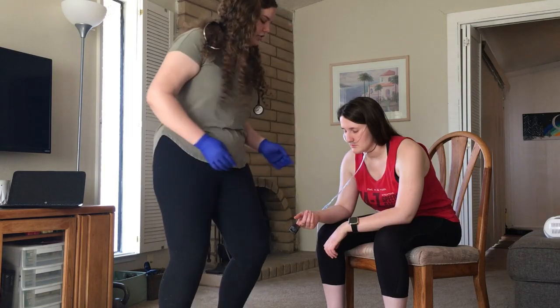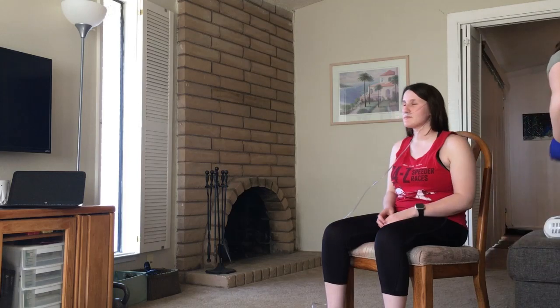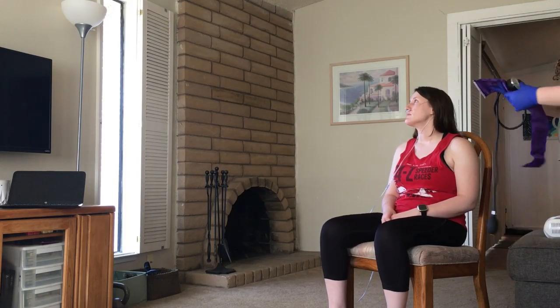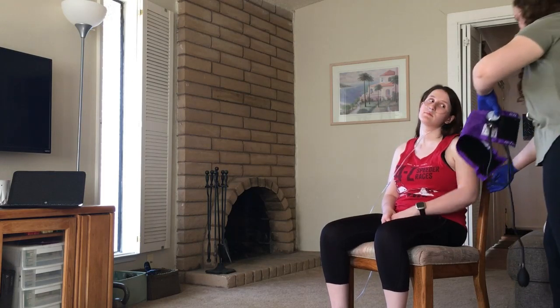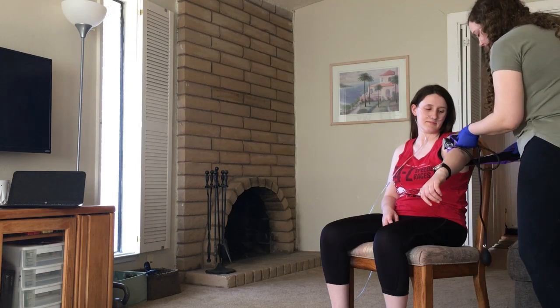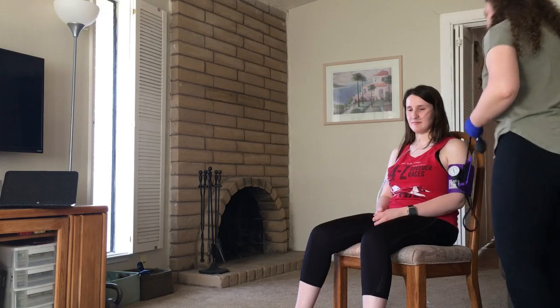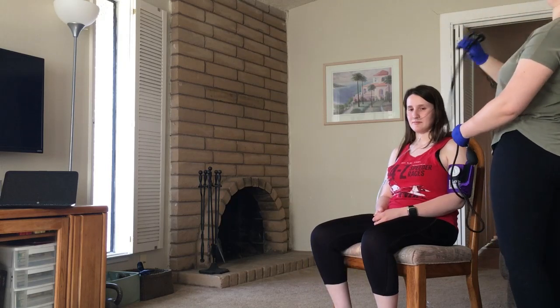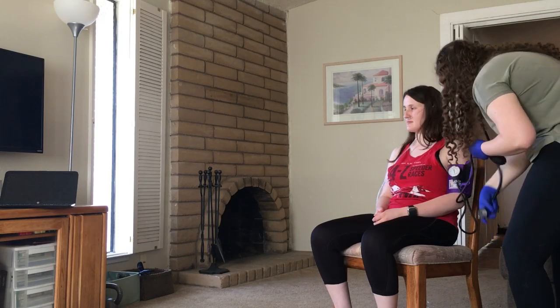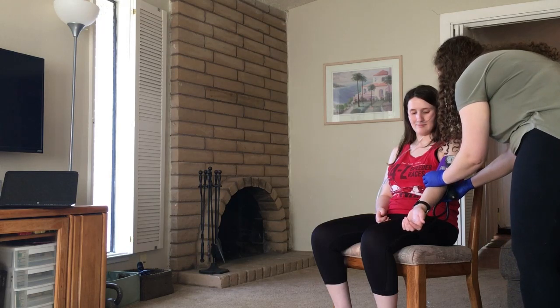Alright, we'll take your blood pressure real quick here. You can relax your arm.